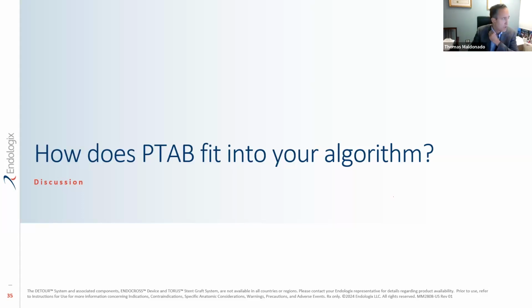I don't know, Vince or Peter, do you have any other pearls about who you would treat with a DETOUR PTAB procedure? Yeah, I think you've outlined it perfectly, Tom. Actually, it's patients who failed endovascular therapy and you may have a fibrotic lesion, something inside of that SFA or that POP system that is resistant to endovascular intervention, and they keep going down. And I think that's a perfect candidate for somebody like this, because that conduit is basically lost. It's no longer something that can be used and relied upon. So this gives you an entirely new pathway.